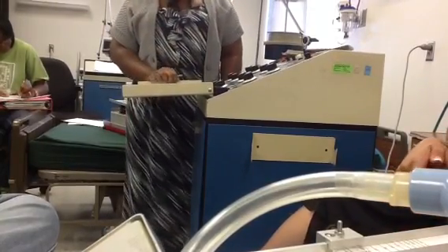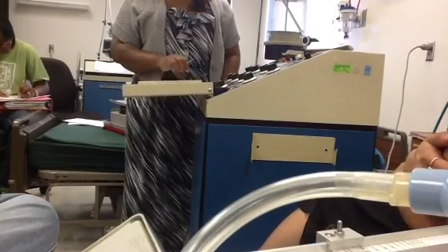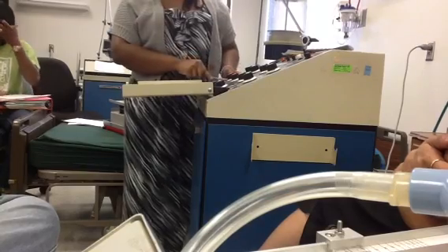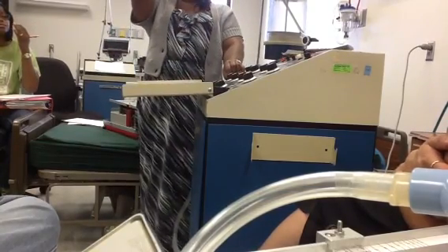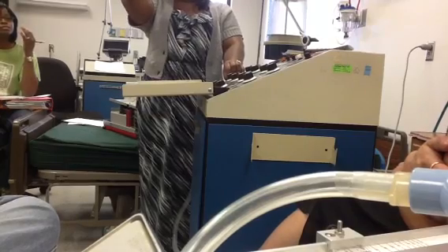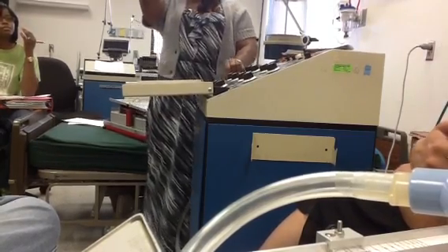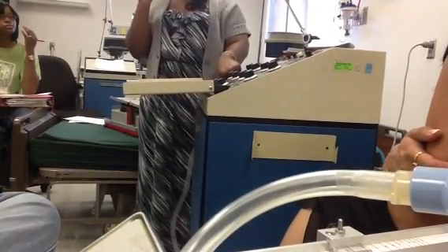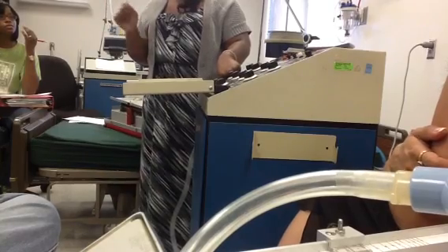Peak flow, you would do what you calculated. We already did that, because we set it when we put it up before we put it on the patient. On that one, you may have to check. That's the inverse I:E one, right? On that one, if the inverse I:E ratio goes off, you turn the peak flow up just a little bit, but still chart what you calculated.